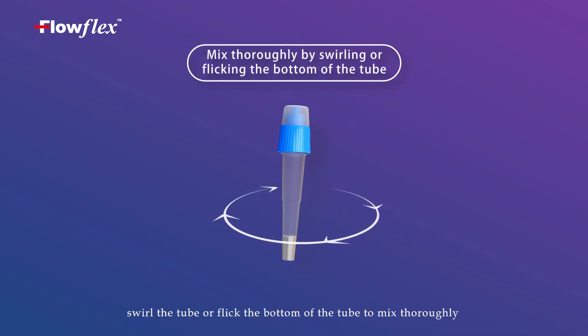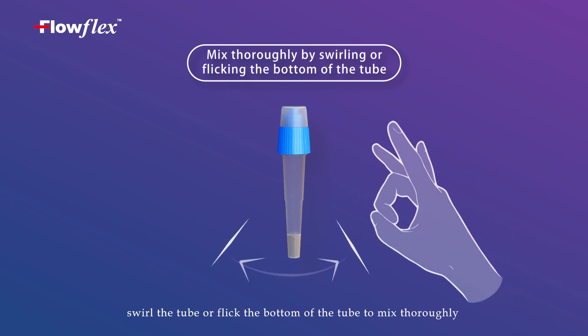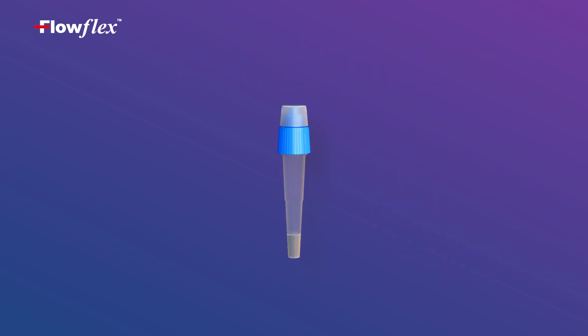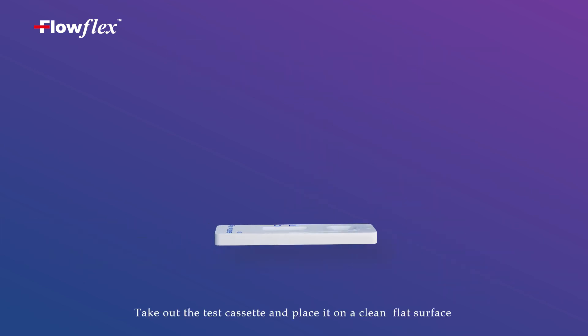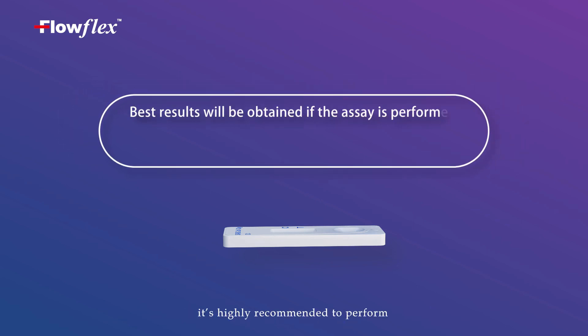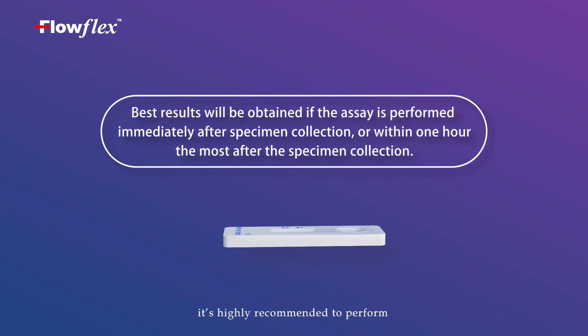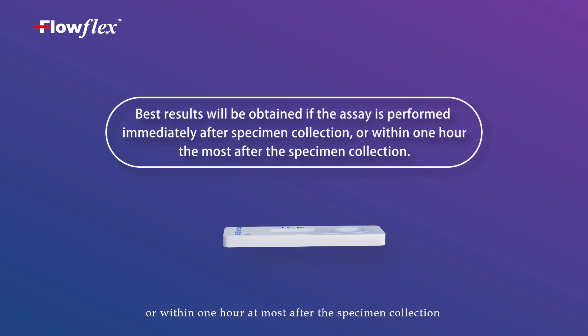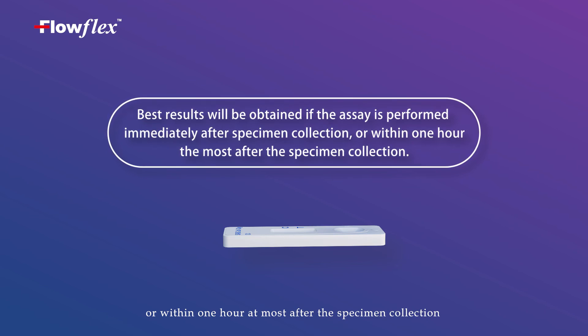Flick the bottom of the tube to mix thoroughly. Take out the test cassette and place it on a clean flat surface. For a good result, it is highly recommended to perform the test immediately after specimen collection or within one hour after the specimen collection.